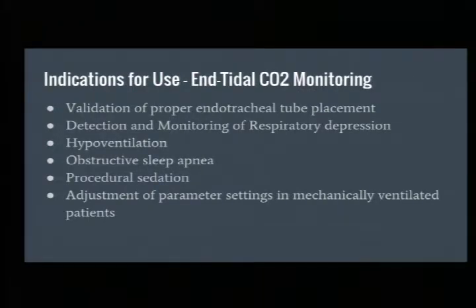So, indications for use of end-tidal CO2 monitoring: to validate proper tube placement after endotracheal intubation, detection and monitoring of respiratory depression, hypoventilation, obstructive sleep apneic patients, procedural sedation like I talked about in the ER, and adjustments in your parameter settings in vented patients. We have a whole vent lecture we'll go through later.